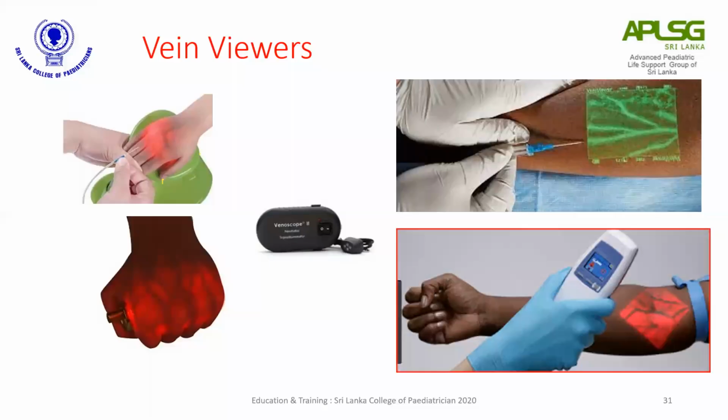The other problem is that it will give us just a two-dimensional view, so we don't have any idea about the depth. A little improvement can be made using a pole light, which is in the first picture. When you keep the pole light here, of course, you can get some idea about the depth as well. So in difficult cases, especially in chubby children, you can use a vein viewer to find a good vein.